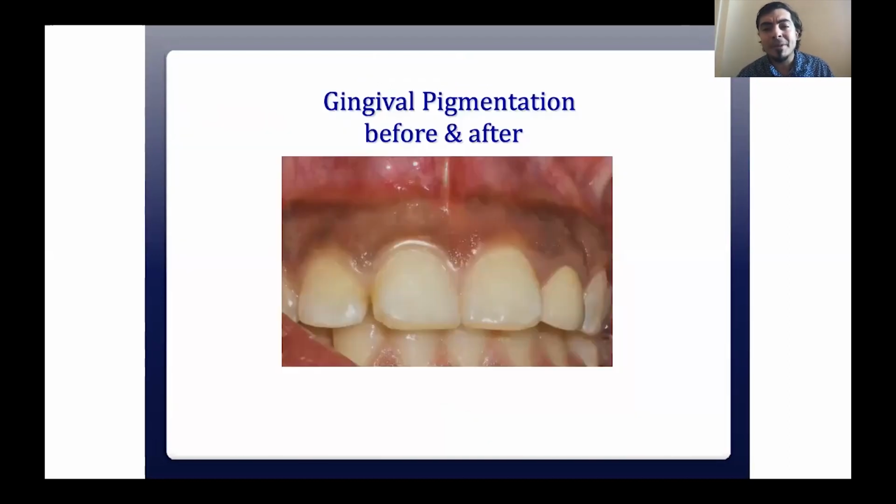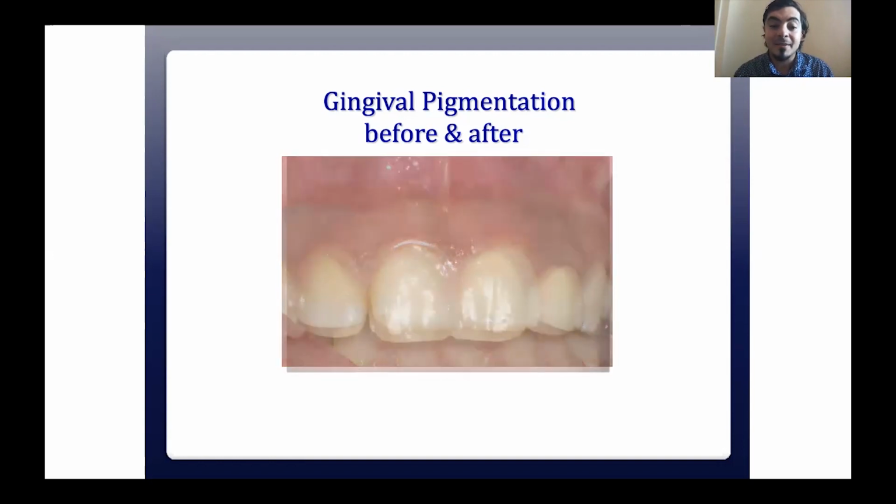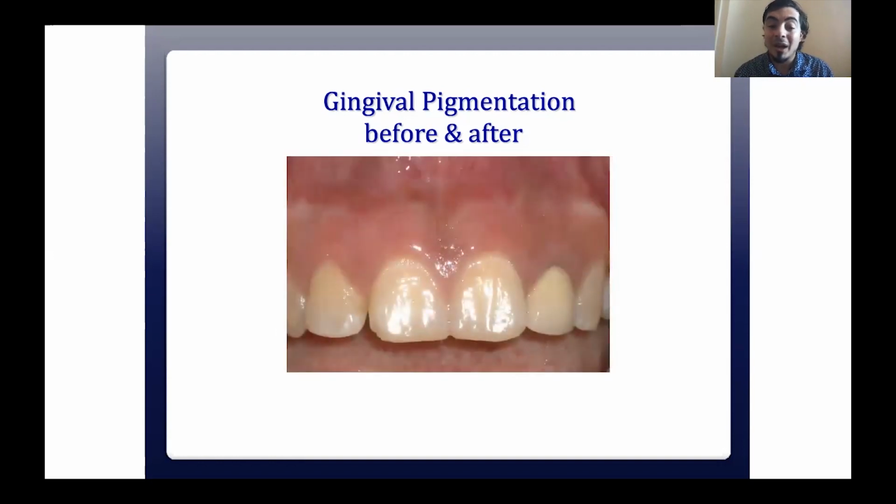One of the most common procedures, especially in the Middle East actually, is gingival depigmentation. It's removing or scoring the outside layer to be able to reduce the darker coloration and reduce the pigmentation of the skin to be able to get a much lighter appearance underneath it. And a classic case like this, if treated well and done well, and it takes time, it's not a quick case, can actually yield some really, really nice results for patients.